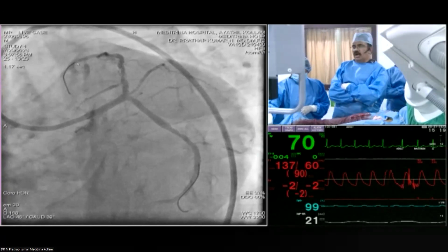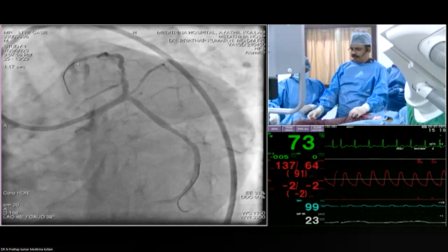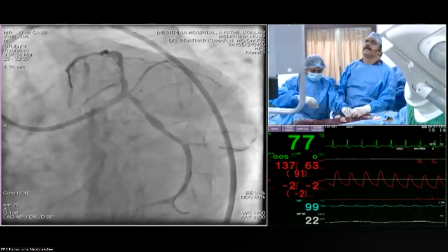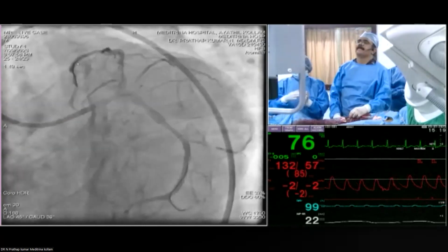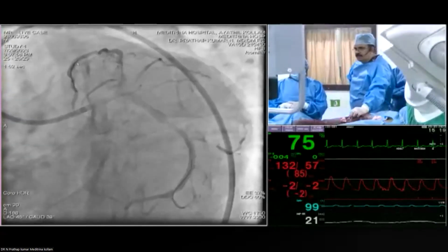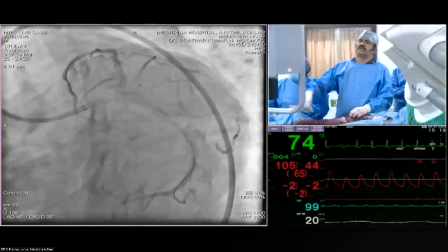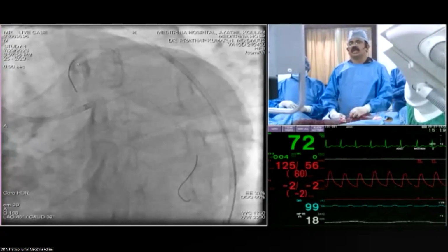I'm not sure, but probably if you stent from left main to circ, perform POT, and then perform final kissing for LAD, and treat this proximal LAD segment with a drug-coated balloon, because it's in-stent restenosis, you could go with a drug-coated balloon approach. That's actually a very good suggestion, but I just wanted to put a stent from LMCA to LAD, where the drug-coated balloon cannot do anything.